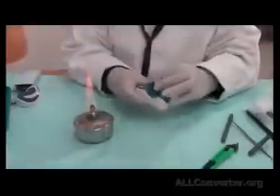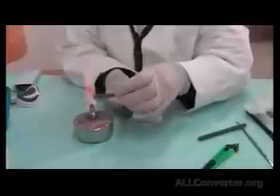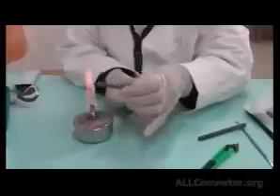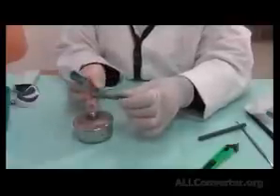So I'm still running on the same principle. On the distobuccal angle, I'm still going with the same principle. Now, if anything flows on the tuberosity, this is okay. Tuberosities can withstand pressure, and they are preferably compressed. So I'm not bothered if the material goes into the fitting surface in the tuberosity area, but I would bother if it comes in the anterior area. I'm going to add the other distobuccal angle.